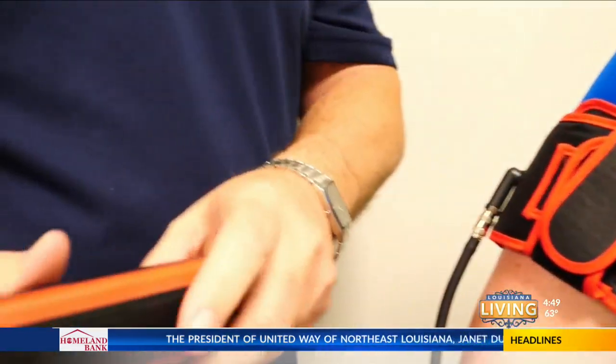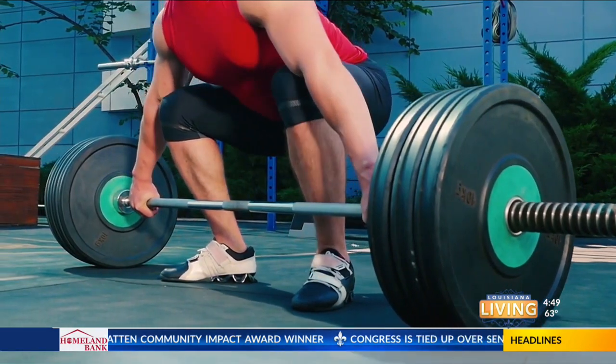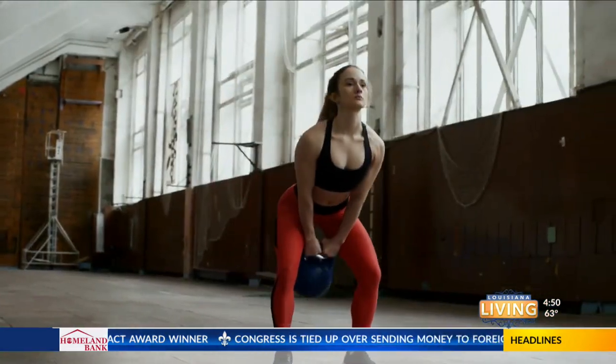We are going to talk about blood flow restriction training. Blood flow restriction training has been utilized by weightlifters for a long time, but it's really become a newer innovative therapeutic device that we use in physical or occupational therapy.